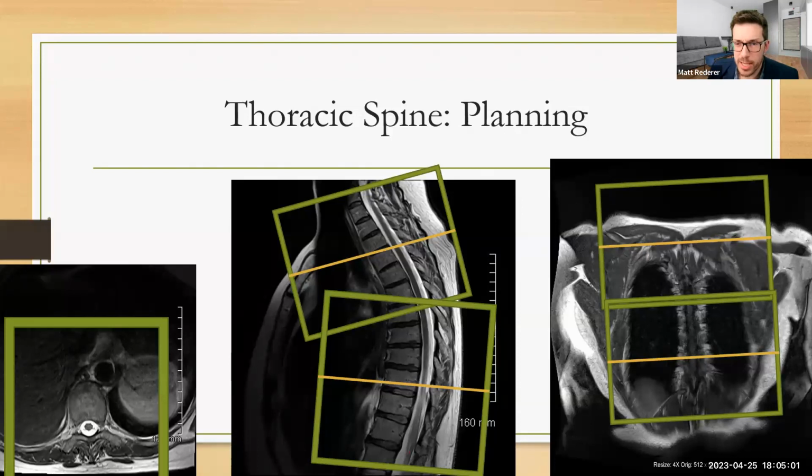So here's a question. Can you tell us what protocol these images are? This is the thoracic spine. So we're doing a thoracic spine axial image. So let me write axial up here. Surprised I didn't put that up there. Axial set. So to get an axial image, I need to use my sagittal and my coronal, the 2 other views.